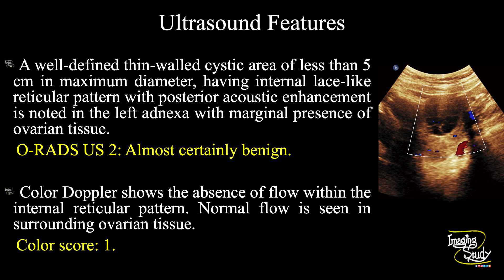In summary, a well-defined thin-walled cystic area of less than 5 cm in maximum diameter, having an internal lace-like reticular pattern with posterior acoustic enhancement, is noted in the left adnexal region with marginal presence of ovarian tissue. Color Doppler shows absence of flow within the internal reticular pattern, and adjacent surrounding normal ovarian blood flow is seen. So the lesion is an ovarian hemorrhagic cyst.